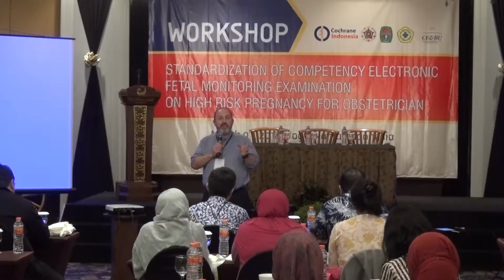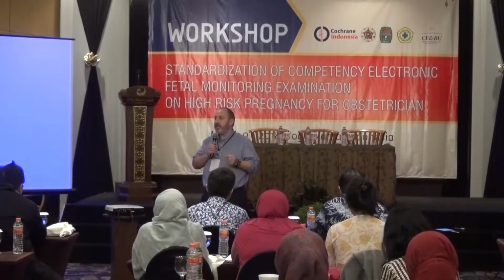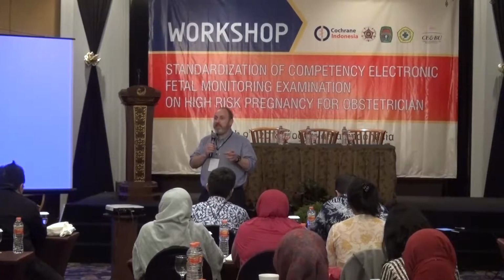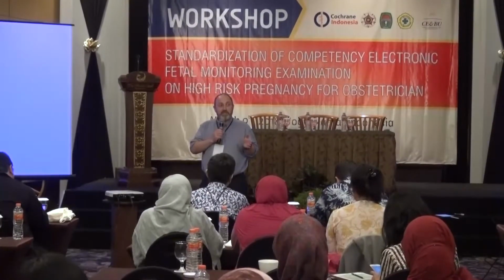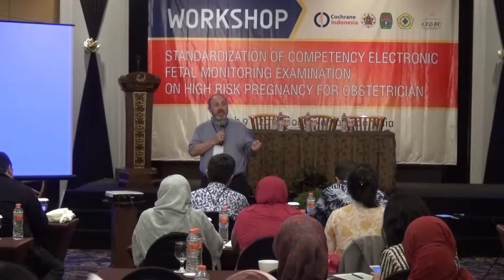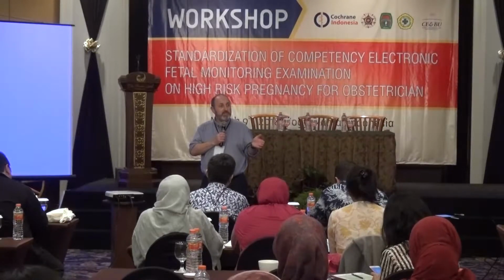At what point during labour would you normally see early decelerations in particular? During contraction, exactly. And what stage of labour in particular? Second stage. So early decelerations are most commonly seen during contraction, late in the first stage, and during the second stage of labour, suggesting they have something to do with head compression, isn't that right?